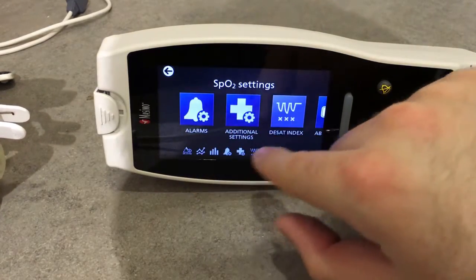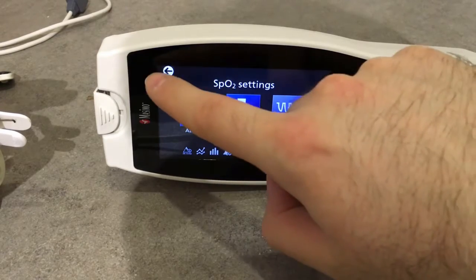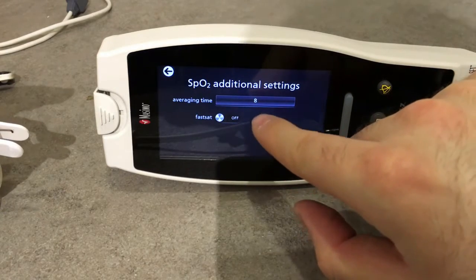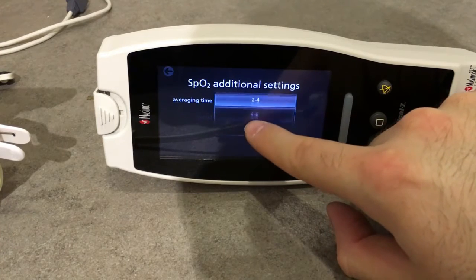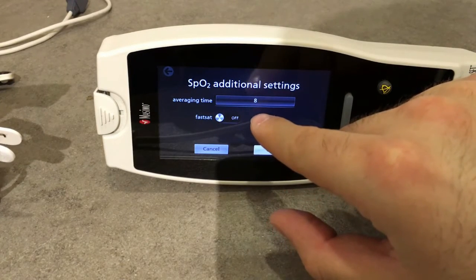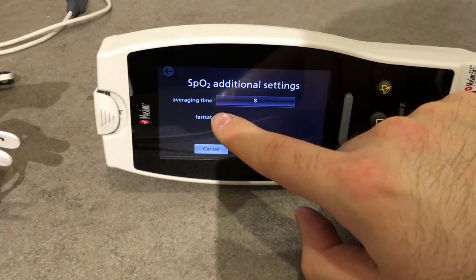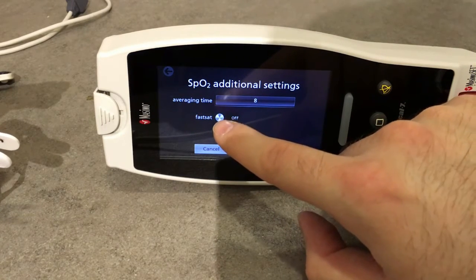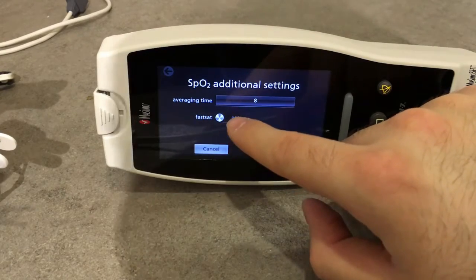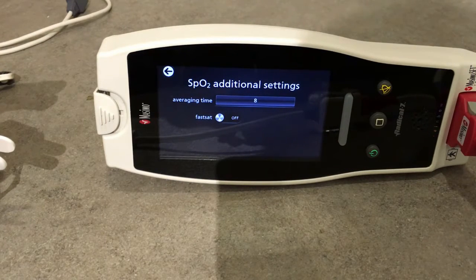By clicking on a value we go into its settings where we can set the alarms. We can set the averaging time and the fast set for SPO2 — we can go down to two seconds on averaging time. A shorter averaging time allows for high-fidelity pulse oximeter performance, whereas with Fast Set enabled we enable rapid tracking of arterial oxygenation status changes. We can set these accordingly to our patient's situation.